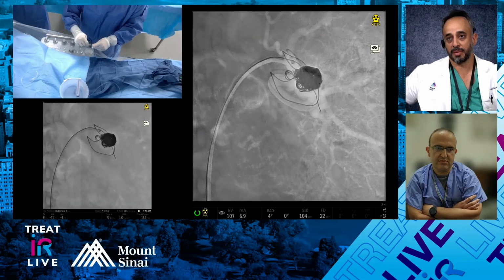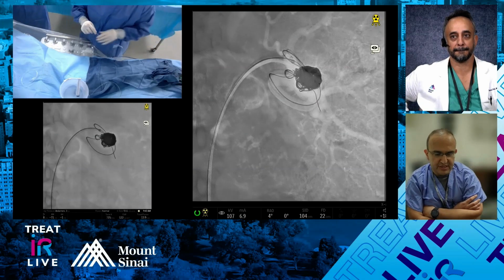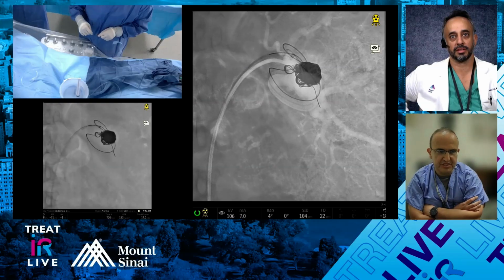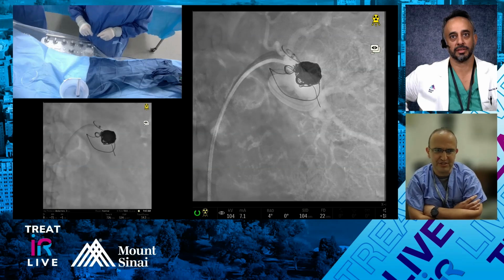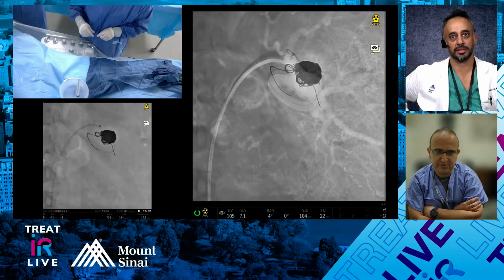So, I mean, we don't do trauma anymore. I think you guys still do. Yeah, at Georgetown we don't get much trauma, but when I was at the hospital center, definitely. Like you said, I'm old school too. I oversize a little bit. And like you said, the coil determines it a little bit too, if it's really stiff or soft, and what setting you're in. So I oversize by like 10-15% for most coils.